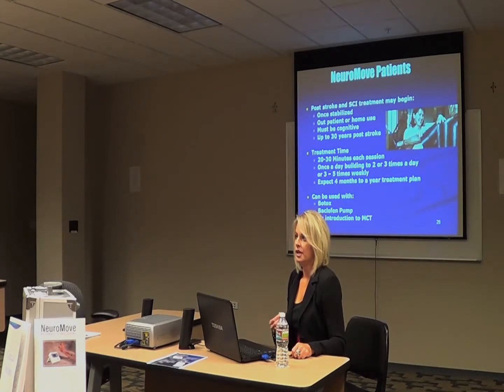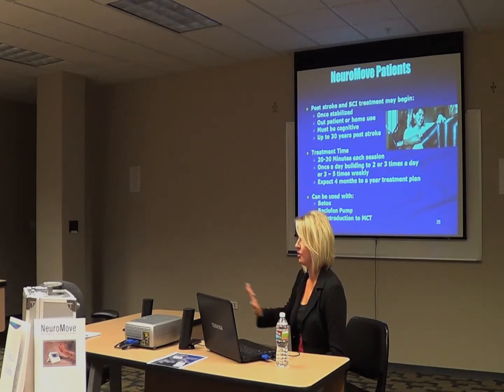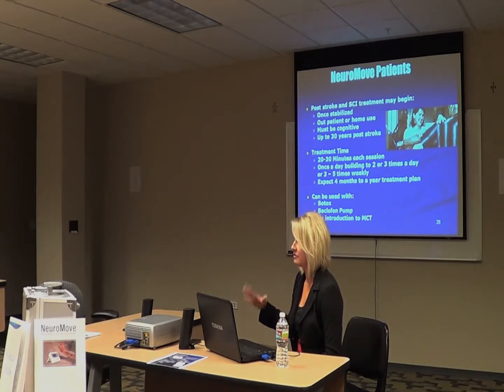We feel like the rewiring process really begins to be permanent at about the 2-month mark. So that means what you've worked with to get them at, there's not going to be any retreating going on. It's going to be pure work from there. What they have is what they'll keep and what they can continue working on.